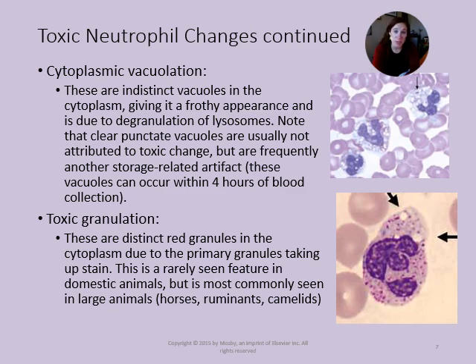Now, the question you're probably thinking is, well, what happens if we draw blood and then we send it out? So you have a patient come in for a wellness exam and you draw blood at 5 o'clock, but Antech or IDEXX, which would be a separate lab entity where you send out blood work, doesn't pick it up until tomorrow morning. Is that going to cause an issue? No, because hopefully you're storing it in the fridge, and hopefully you put the right amount of blood into the right amount of anticoagulant where you wouldn't see this issue.